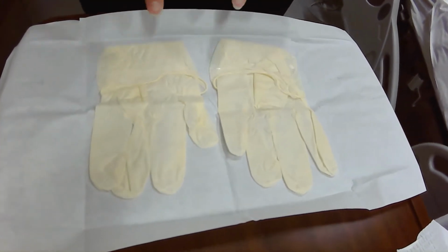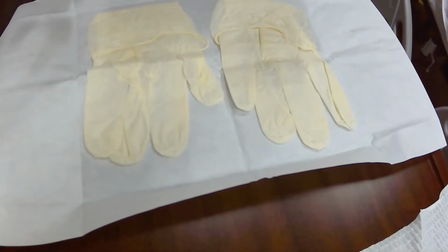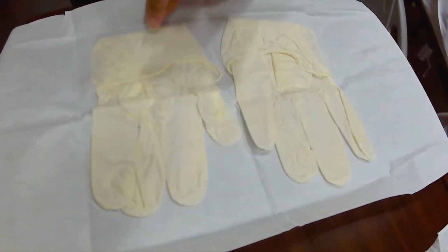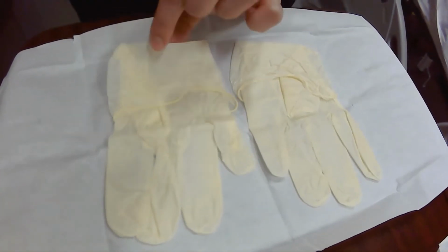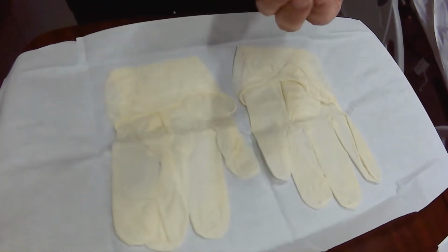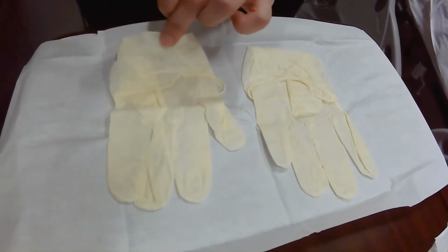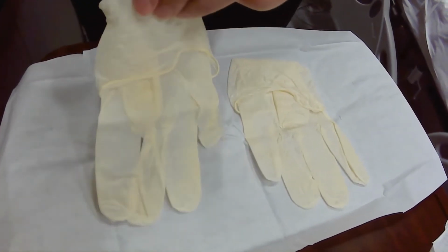Alright, so this is not sterile, this is sterile. So when I'm picking it up, I am going to pick it up with my left hand, which is my non-dominant side. So see how I'm picking it up by the inner cuff, the lower part of the inner cuff, because this hand is not sterile, so I need to touch non-sterile to non-sterile. You just have to be careful because sometimes they are a little bit stuck, so you have to try to separate it, okay?